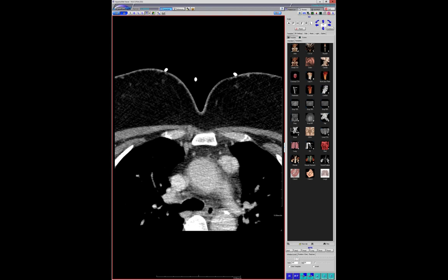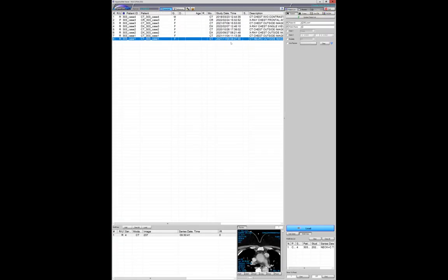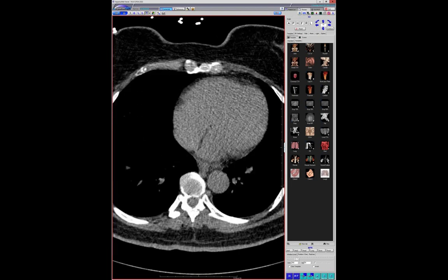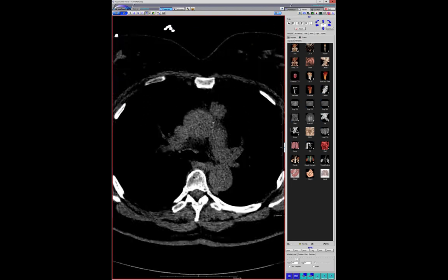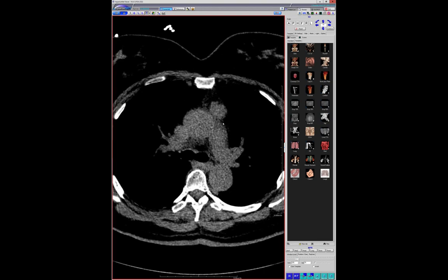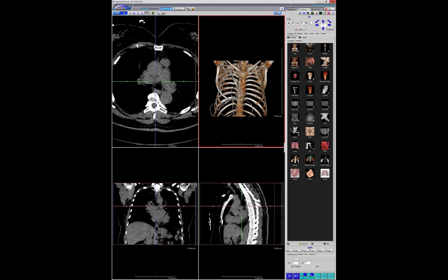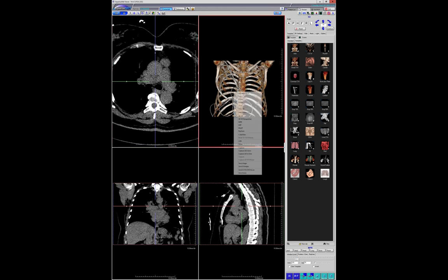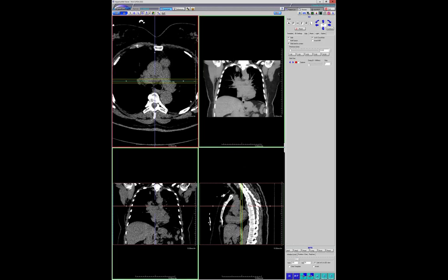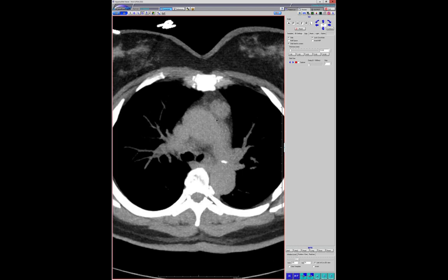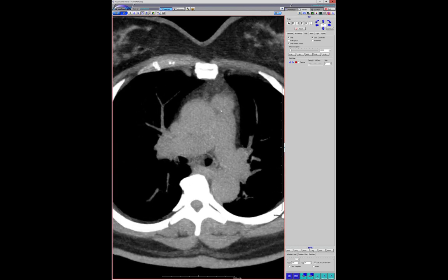Were there any phleboliths on the non-con? The non-con was from outside. There are some punctate little things, but it could be noise too — too small. Most of the phleboliths I see are in slow flow vascular malformations rather than hemangiomas per se. When we get the full pathology report — they just took this out a couple of days ago — on frozen they said it's classic hemangioma. I'll see if they note phleboliths on final pathology.